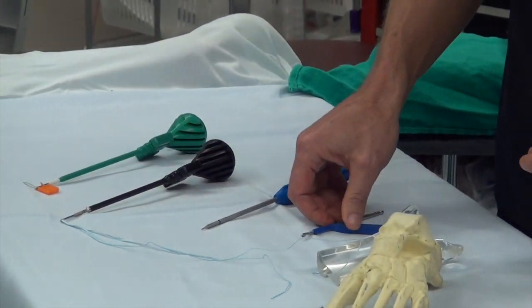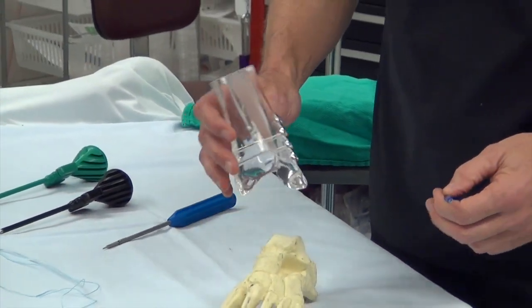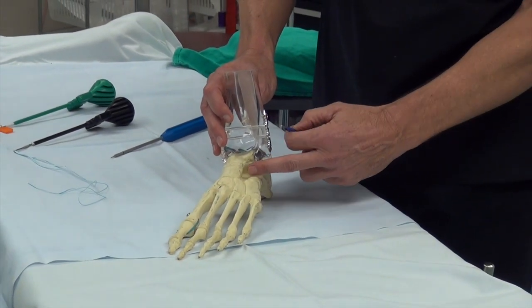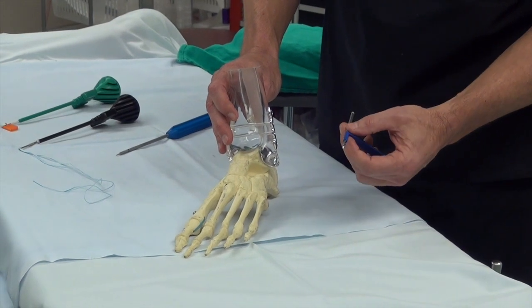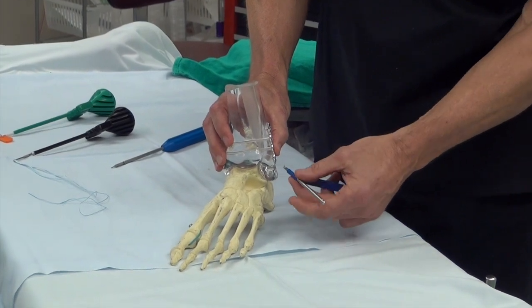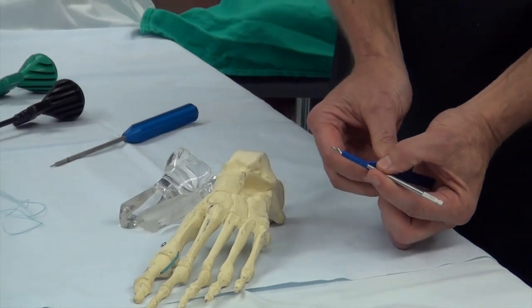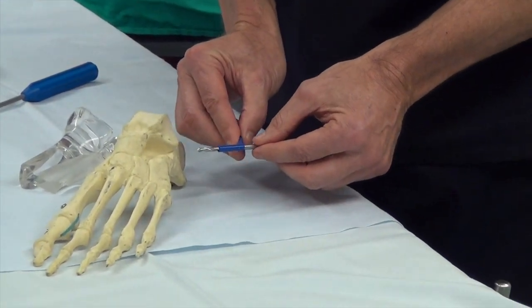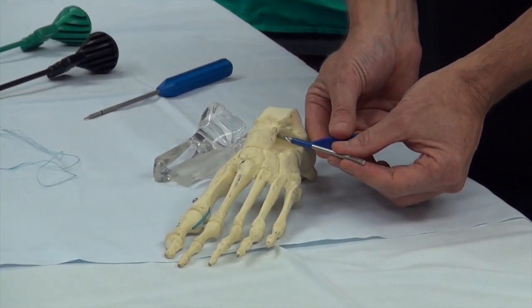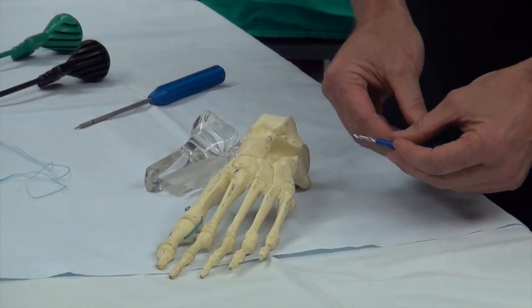What's unique is the instrumentation, which makes it easy inside the operating room. Once this ligament is repaired via the modified Broström to the outside of the talus, this depth gauge and drill formed on the fibula will drill in this way and stop before it exits the back — it has a stopping mechanism right here. Then once you're done with the fibula, you can drill back into the talus at a similar angle, and it will stop and sink down above. Then you have your two holes.